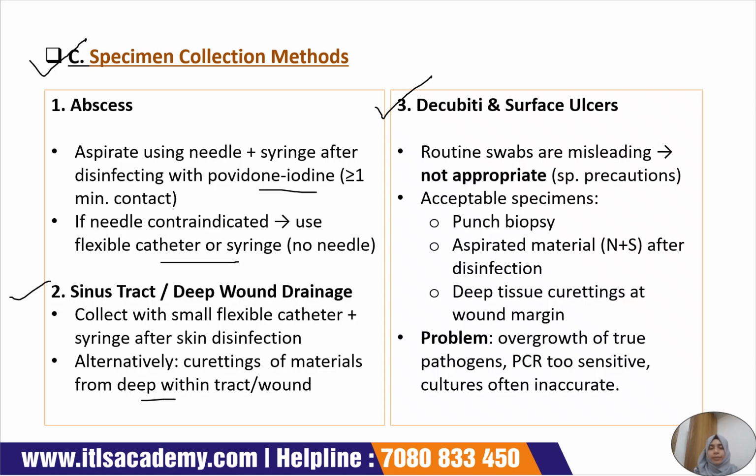There are acceptable specimens in this particular case, which involve punch biopsy, aspirated material extracted via needle and syringe after surface disinfection, and tissue curettings at the wound margin.